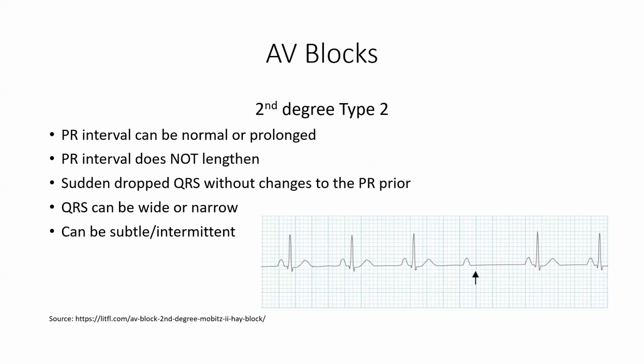As first responders, it's very possible that you have seen or will see people with higher grade AV blocks. The PR interval does not lengthen.